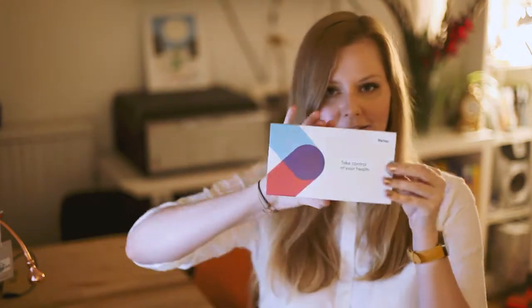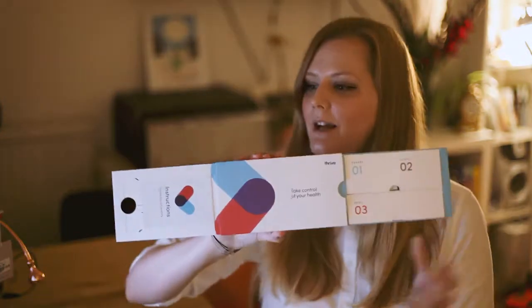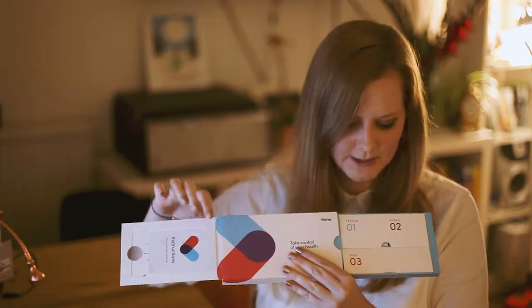If you want to know what's in this test, we shall open it up — here you have instructions and here you've got all the bits to do the test.